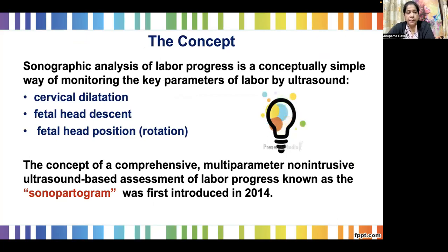Now, the main concept is that the sonographic analysis of labor progress is a conceptually simple way of monitoring the key parameters of labor by ultrasound. Which parameters are to be measured? Cervical dilatation, fetal head descent, and fetal head position.